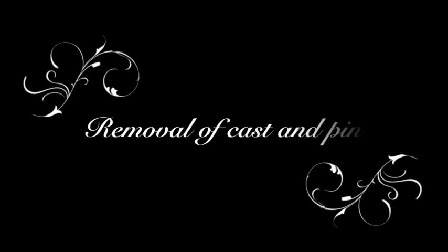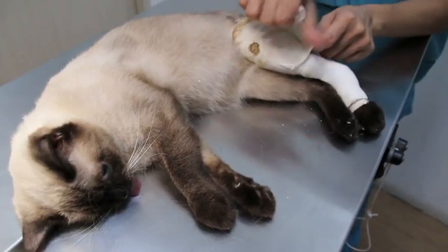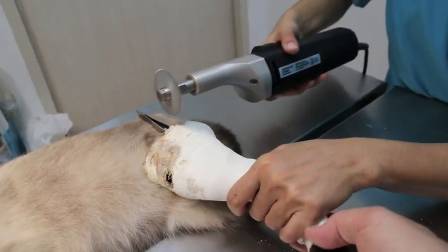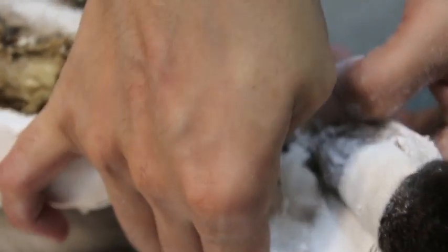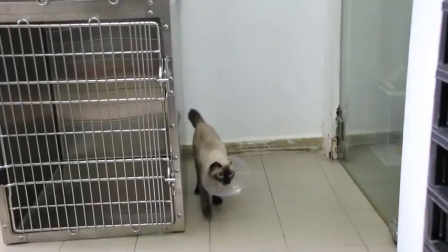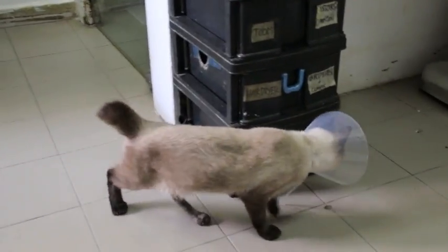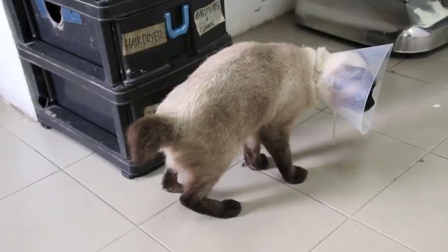Week 7. Removal of cast and pin. The sticky bandage is removed, followed by the cast being sawed open using an electric saw. There is some infection, which is normal and can be treated with antibiotics. The pin is removed as well. This is what the pin looks like. The cat is now able to walk on her own. She is free to go home but must wear an e-collar to prevent her from licking and irritating her left leg.